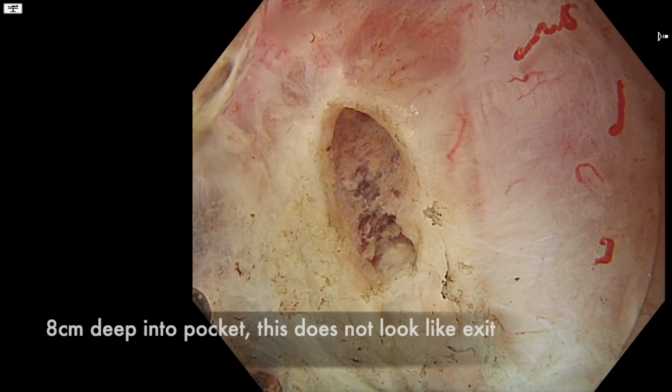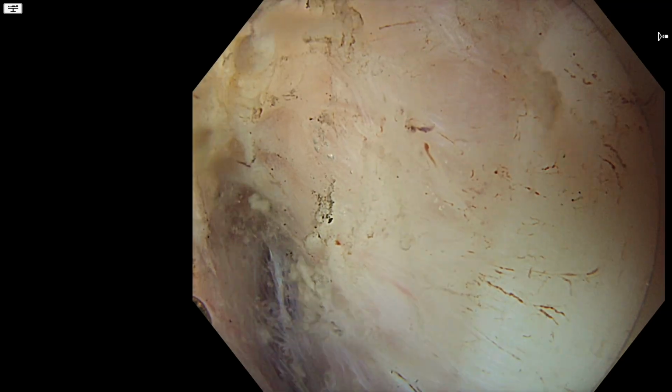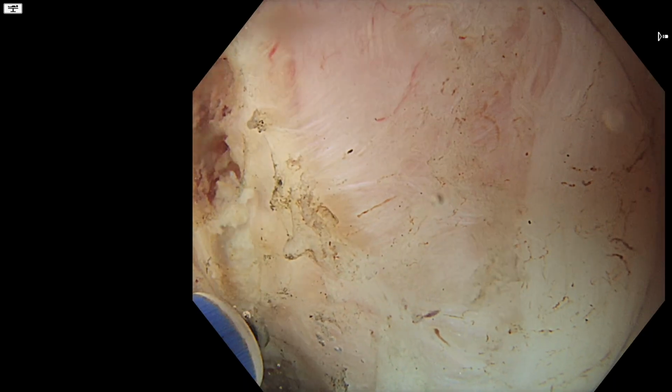Now, when I first saw this, I really wasn't sure what was going on. The tissue there doesn't look clean. It certainly didn't feel as if this was the exit to the pocket.